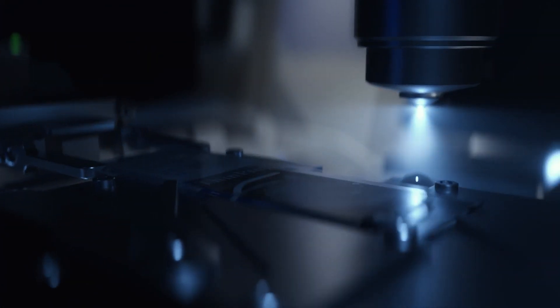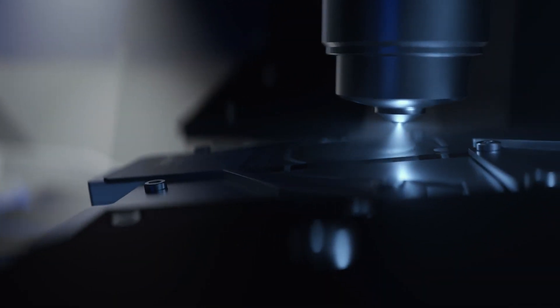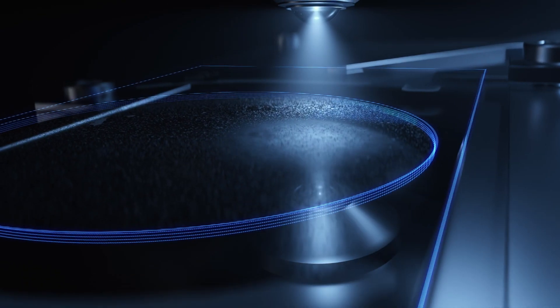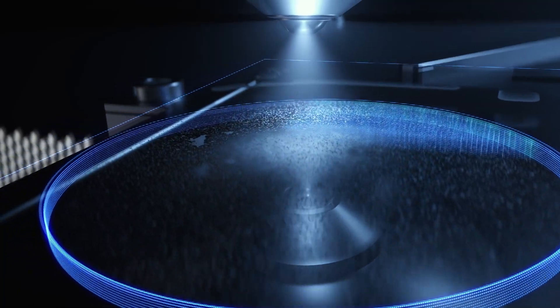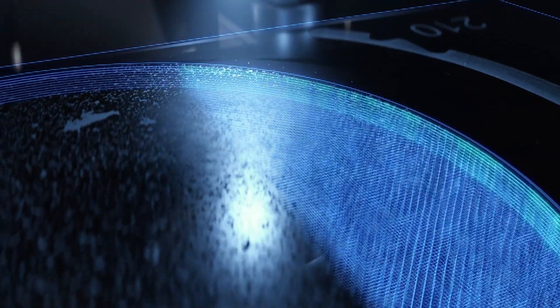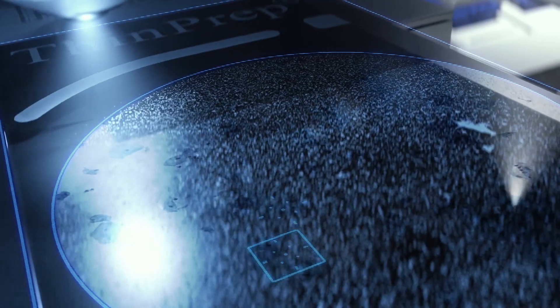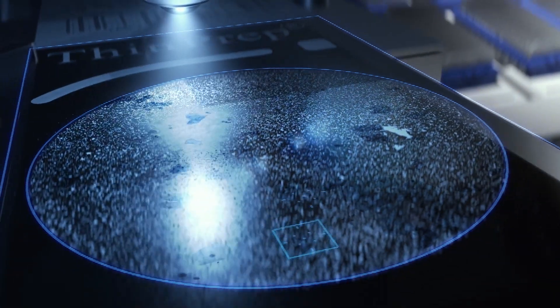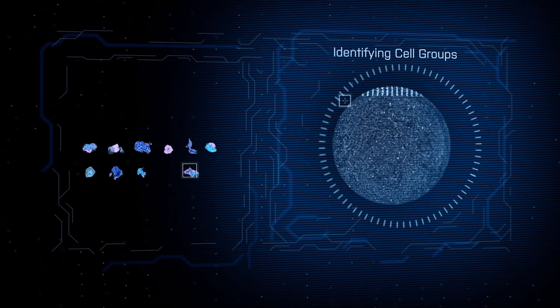Using advanced volumetric imaging technology, the Genius Digital Imager scans the entire cell spot, converting a physical glass slide into a high-resolution digital image. It then merges multiple layers of the slide into a composite image with exceptional clarity, bringing every cell perfectly into focus.